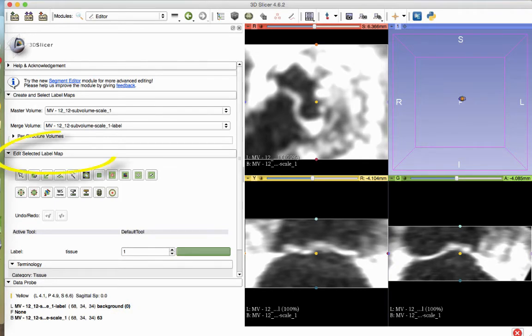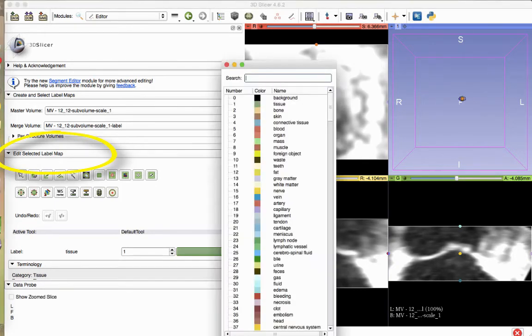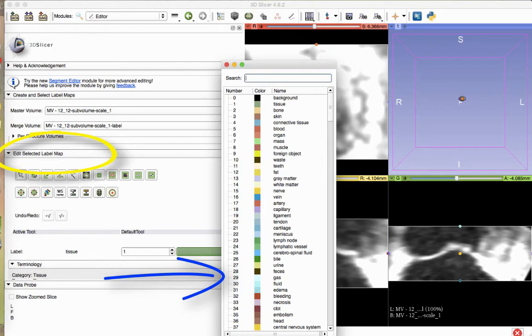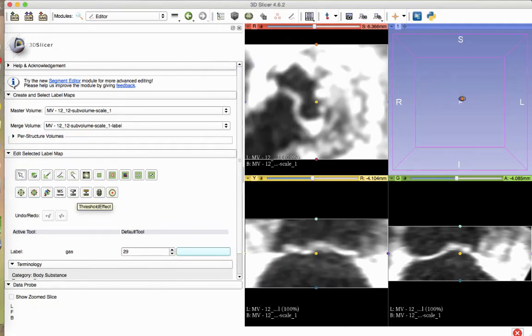In the Edit Selected Label Map section of the Editor module, there is an option to select the label. Any label can be used. Our preference is 29, Gas. The label can be changed by clicking on the colored button in the Label section of the Edit Selected Label Map tool. After choosing your desired label, click the Threshold Effect button.